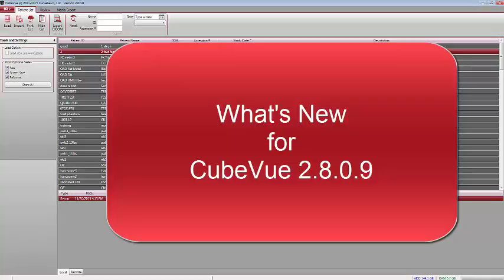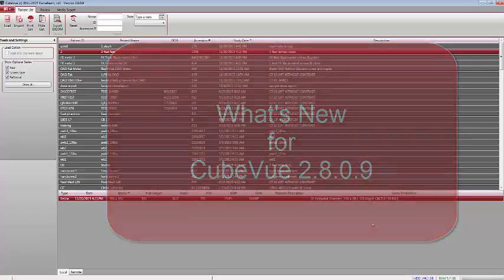CubeView version 2.8.0.9 has just been released, and it has several new tools and features which will improve your workflow and give you a better understanding of the anatomy that was imaged.